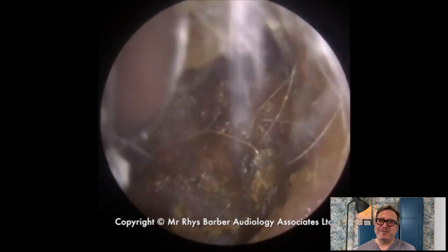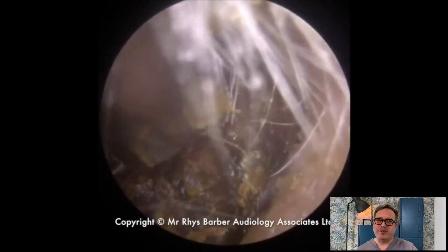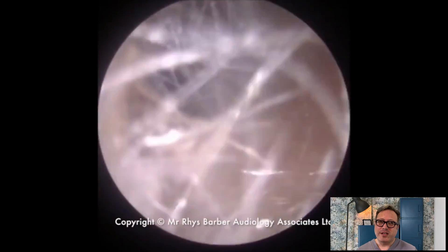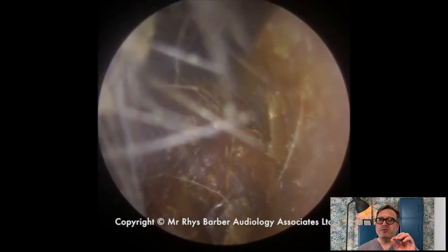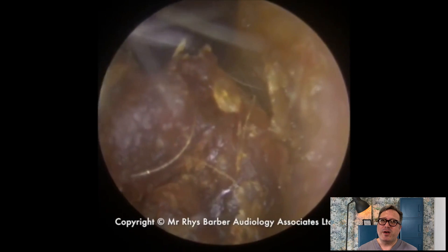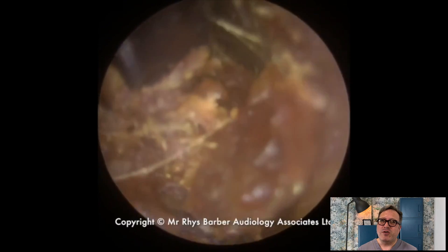It's quite nice for me to look back and see a technique that we did a couple of years back — probably about two to three years ago this video. There's a little bit of dry skin coming away there. Because it's so tough and not really budging, we're going to use the Jobson horn in here. We've got a nice gap at the top to work into, so trying to get behind that front section.